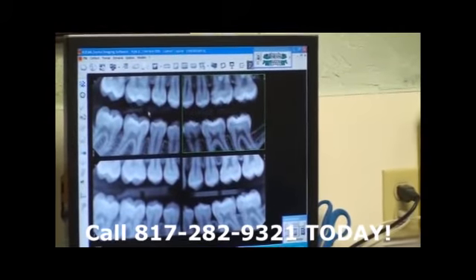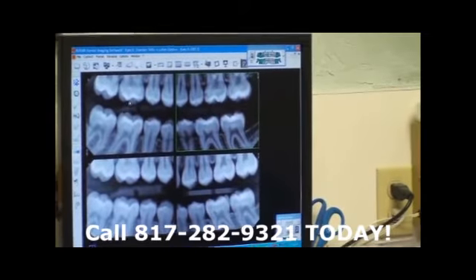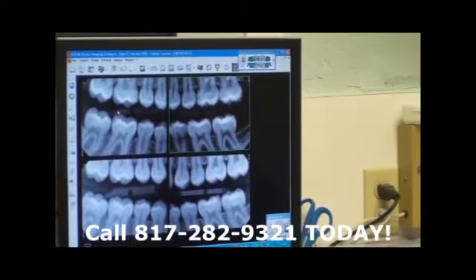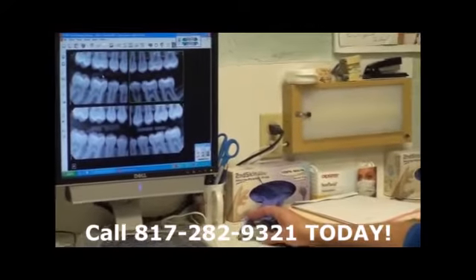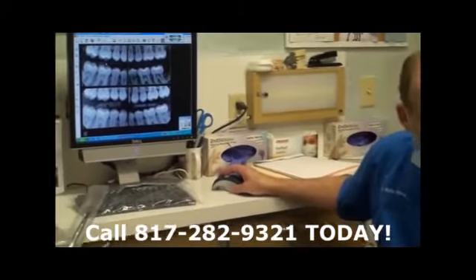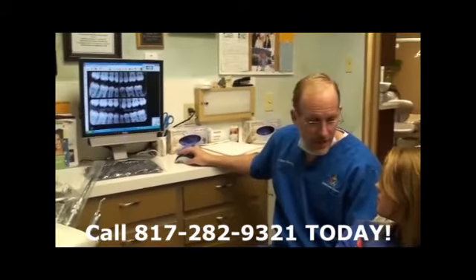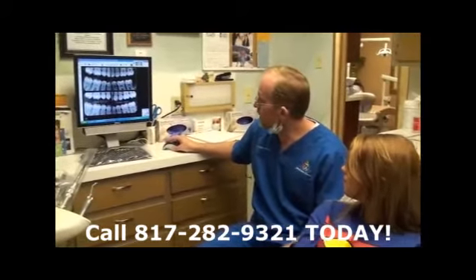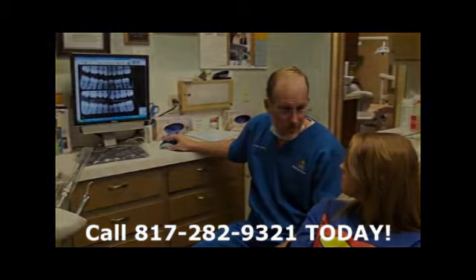So if you find that you're not a flosser, well, if you do some fluoride treatments and start flossing, then all of a sudden you may be able to prevent that from getting worse, and then you don't have to get any fillings done. And so what I'm going to do is take a look in your mouth and see if what we see on your x-rays is the same as what we see in your mouth.